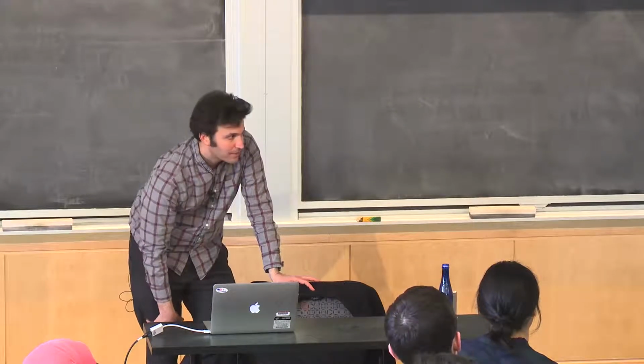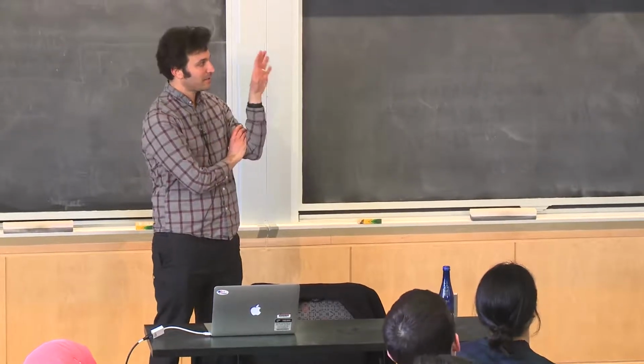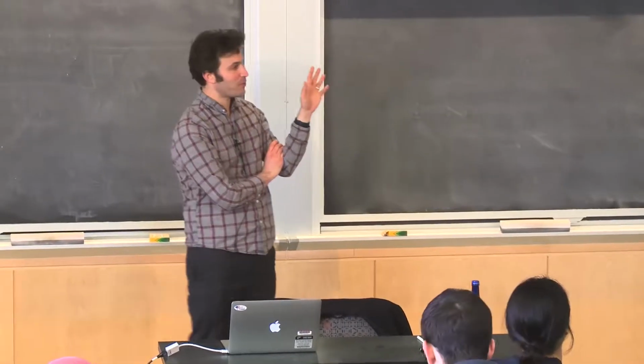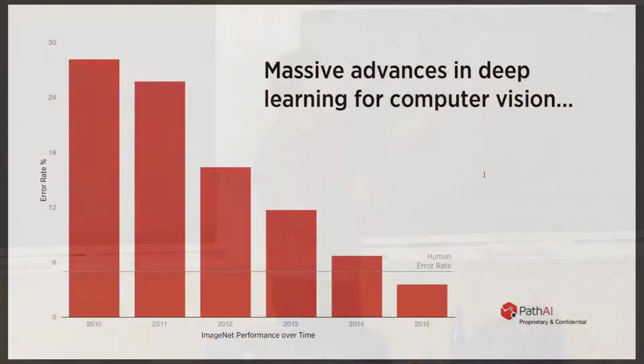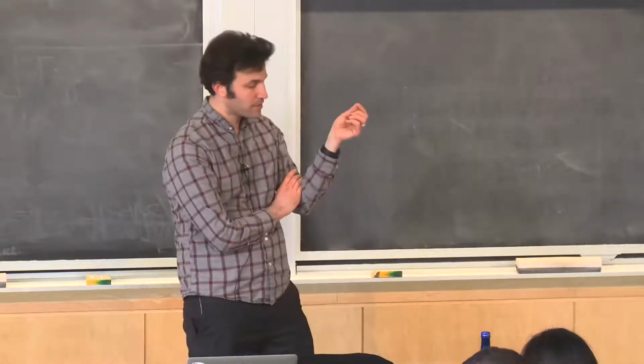So there are a lot of reasons to be pessimistic, but one reason to be very optimistic is that vision is one of maybe 2 or 3 areas where AI is not total hype. Vision really started working well with deep convolutional neural nets in 2012, and then all the groups just kept getting incrementally better year over year. This is an old graph from 2015, but there's been a huge development of methods even since, where now I think we really understand the strengths and the weaknesses of these approaches.